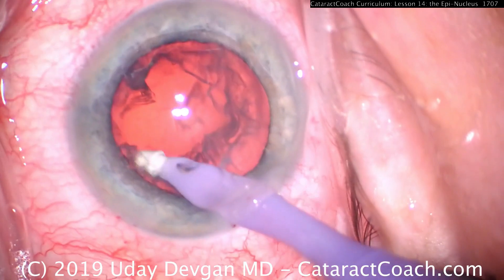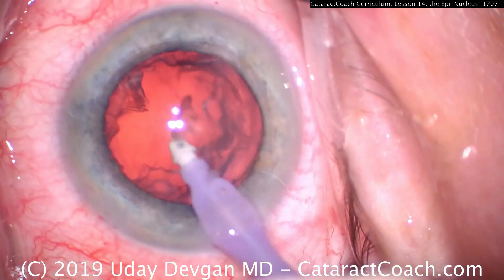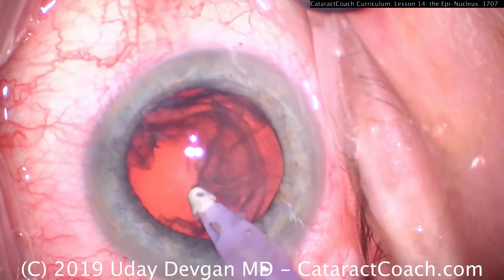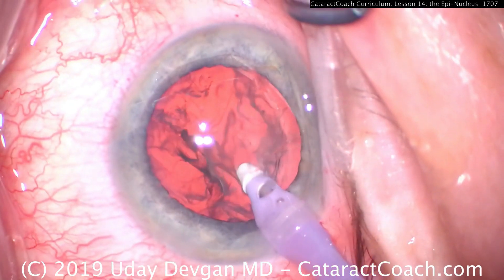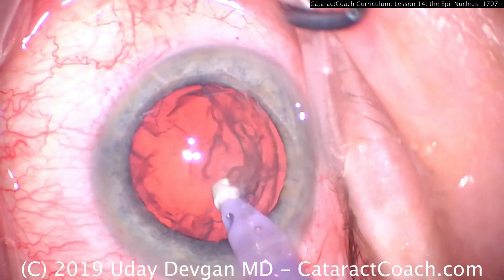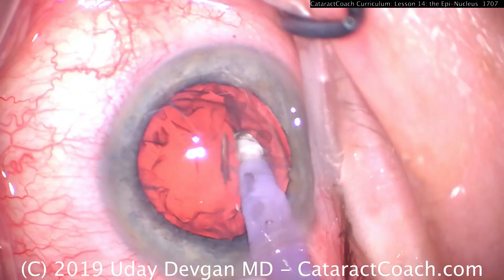Here's a case where we're going to use just the IA probe, and the key is to go around 360 degrees and lift up to get the epinuclear shell away from the capsular bag. Notice how we're going circumferentially, not radially — circumferentially all the way around. We've got to loosen up that attachment. Now it's getting more freed, and the goal is to bring it up out of the capsular bag.